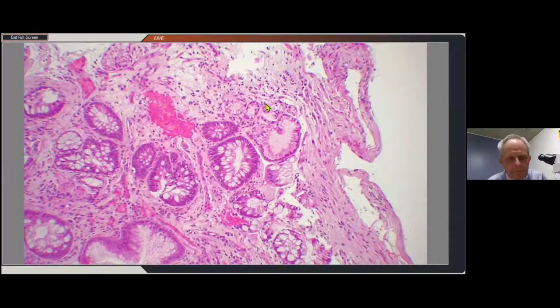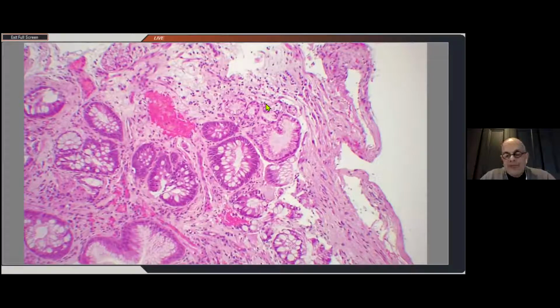And another question from the chat box. Why is it that expert pathologists often downgrade the presence of low-grade dysplasia made by community pathologists? In other words, why do pathologists overread low-grade dysplasia?